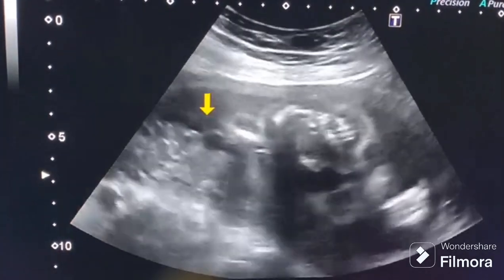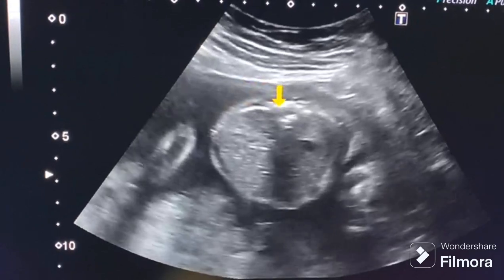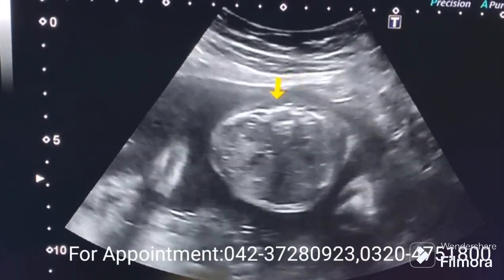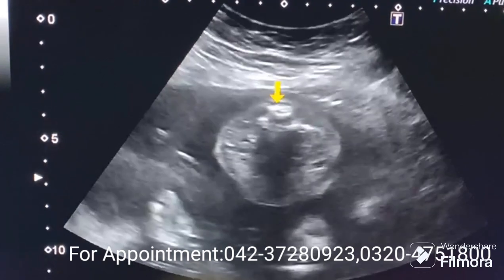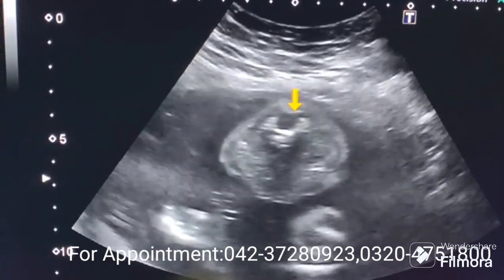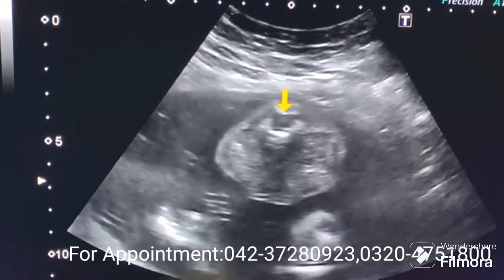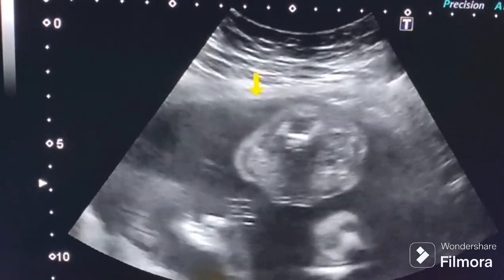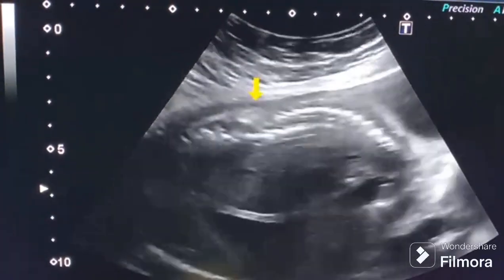And now coming to the transverse view, here you can see the posterior osseous elements are visible with a bright line. It is still visible, and now the defect is coming, and here is the defect. Here you can see there is no posterior osseous element, but the area is covered by skin. So it is a case of spina bifida occulta.